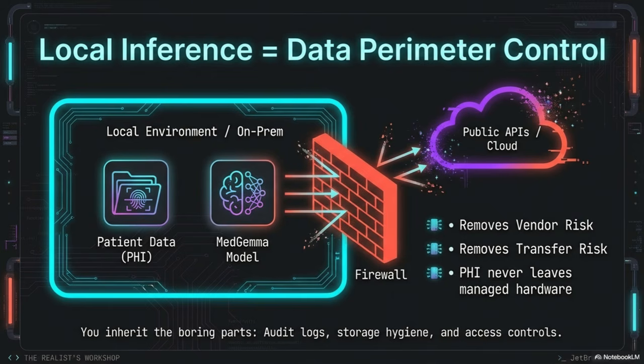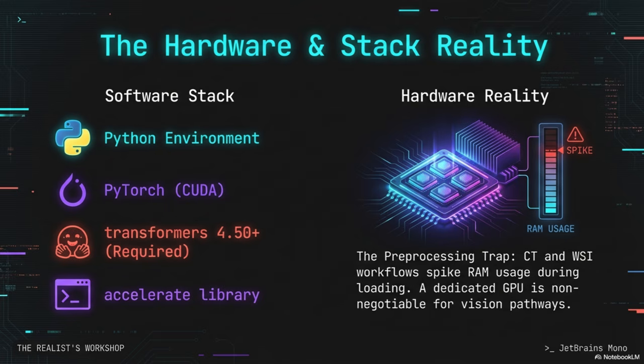You have to deal with operational hygiene. Like what, specifically? Strict data handling. De-identify when you can. Enforce least privilege. Keep meticulous audit logs. You need storage hygiene, making sure you don't leak images or prompts via caches or notebook history or system logs. And human review is mandatory.